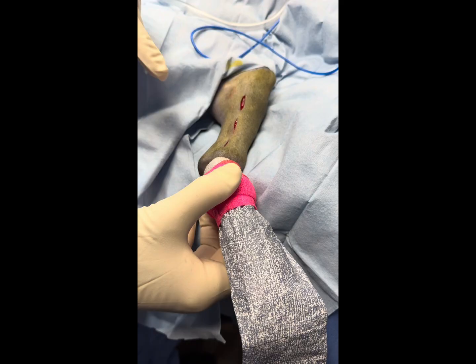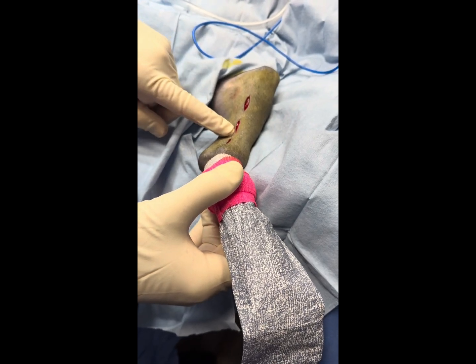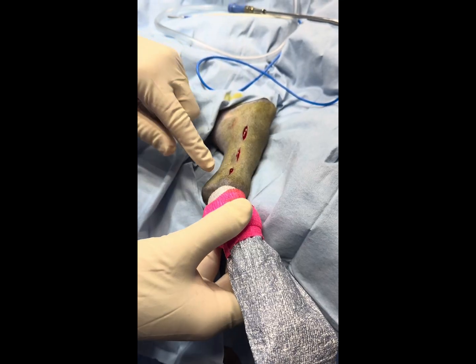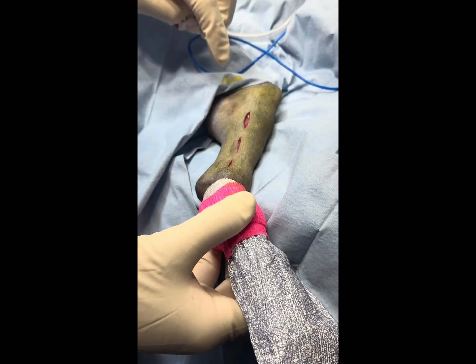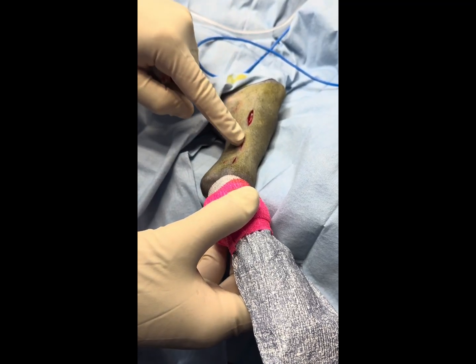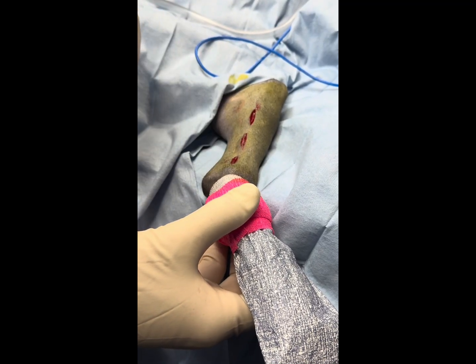What we have here is a diaphysis fracture of the tibia, sitting right here. What I'm going to do is a minimally invasive approach where we make three small incisions, tunnel the plate underneath, reduce the fracture, and place some screws high and low.